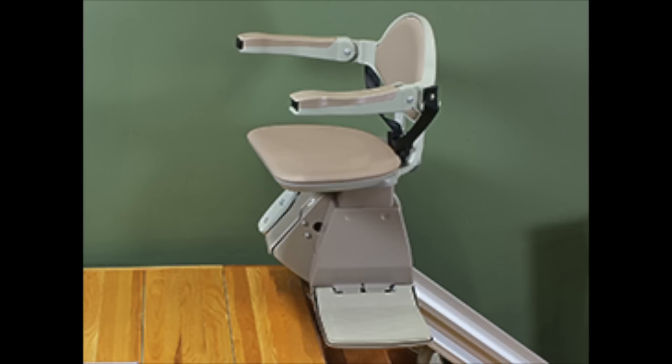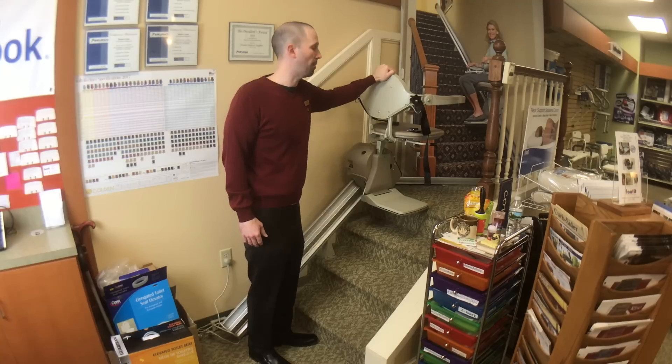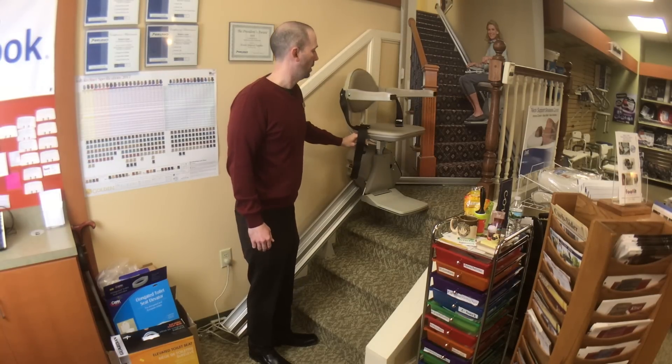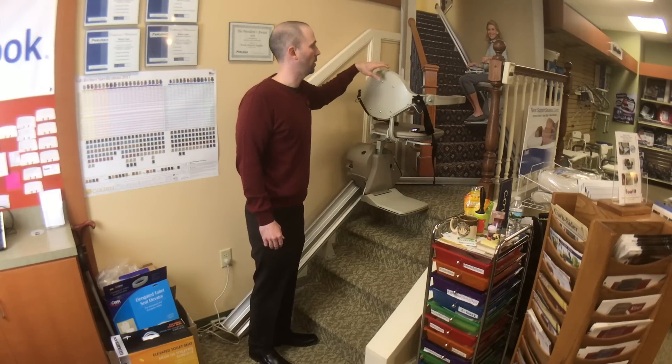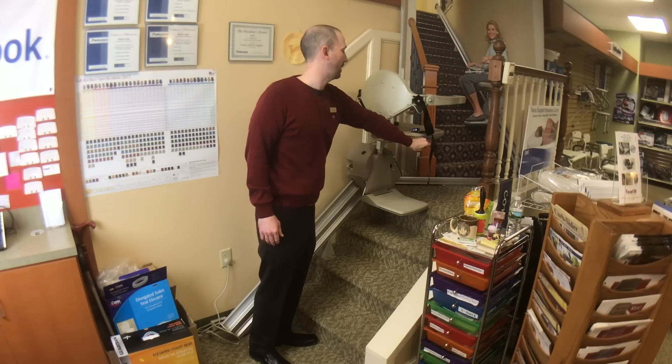There is an option if you want a power swivel — if your loved one has dexterity problems, or we've seen customers who have Parkinson's, muscular sclerosis, ALS, where they can't do it on their own, you have the option of getting a power swivel seat. And what's great when it's swiveled over is when the person's getting off the stair lift, if they ever fall back, they won't fall down the staircase itself — they'll fall back into the seat.